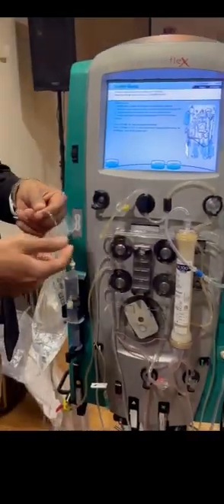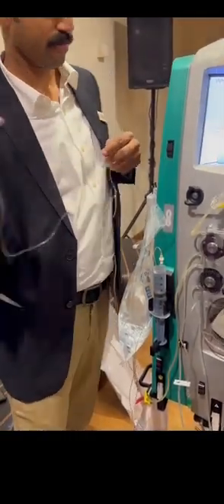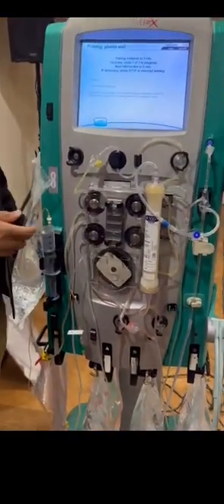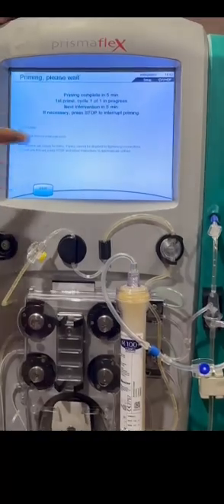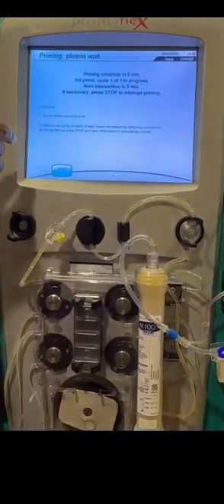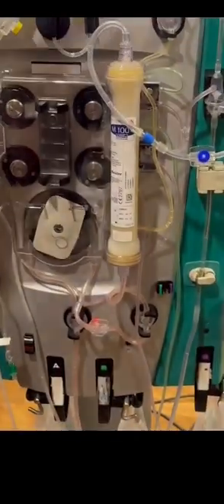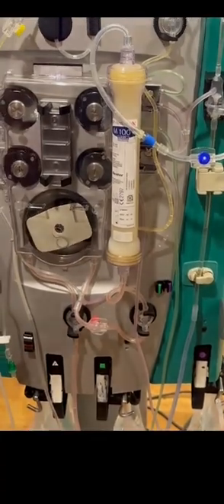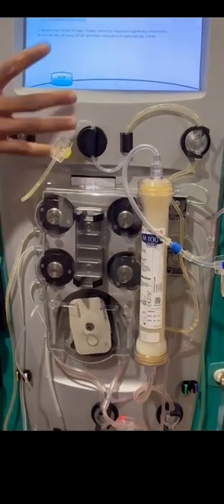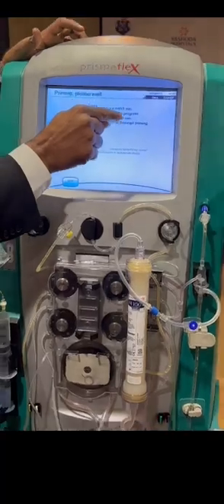While starting the therapy, we'll connect this to the patient's CVP also. You need to prime first and only then do the prime plus test. If I choose prime plus test, that will take the same time. If I prime first, I can check whether there is any air, or just analyze, and then go for the test. Both will take the same time. After the priming only, it will go to the test. Now this will prime in the next 5 minutes, counting down 4 minutes, 3 minutes, 2 minutes, 1 minute.